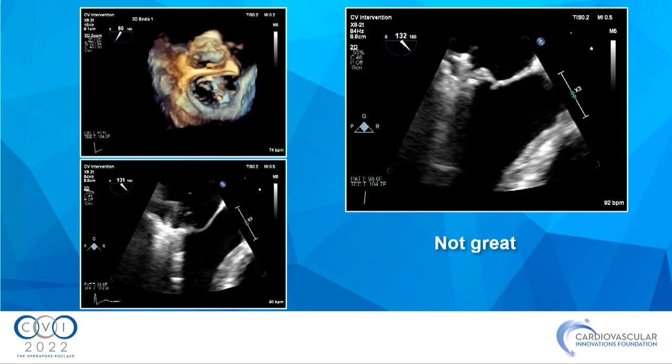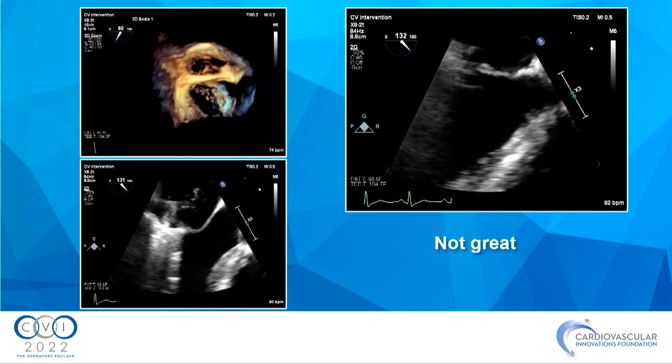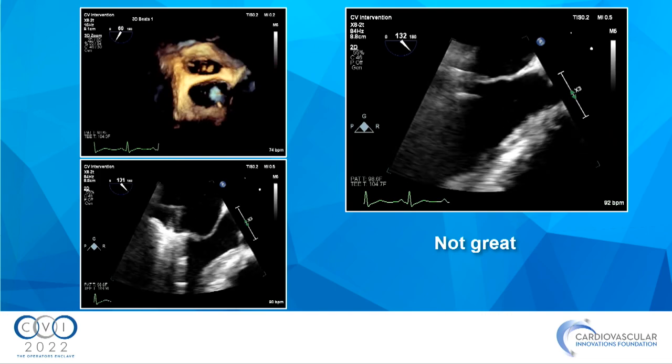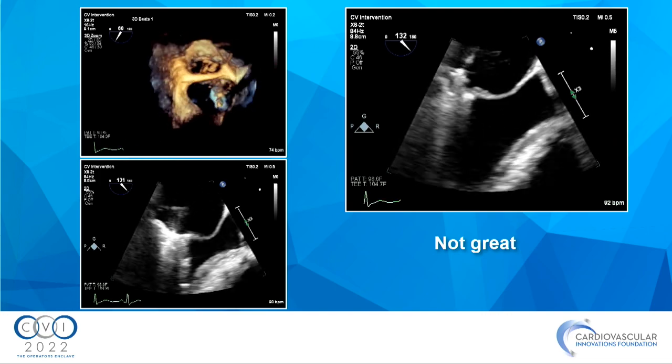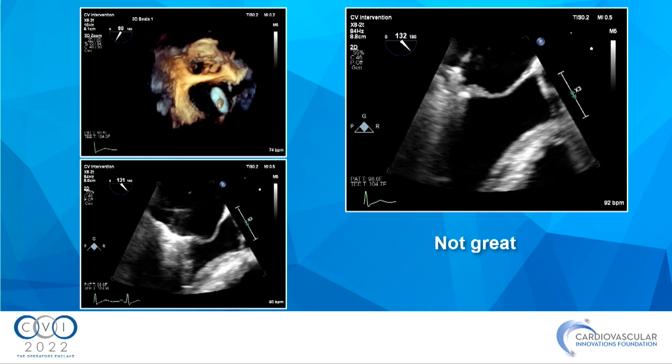Paul, we had a late SLD once that we ended up having to treat on a subsequent procedure. We ended up snaring the first device to stabilize it. And sometimes, I don't know about snaring a pap muscle and how feasible that is, but maybe it provides a little bit of stability.